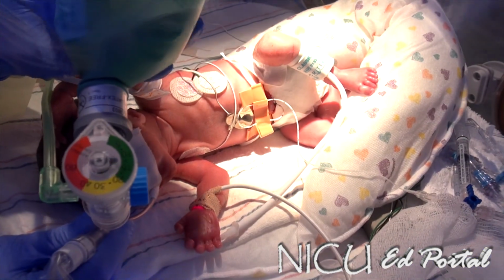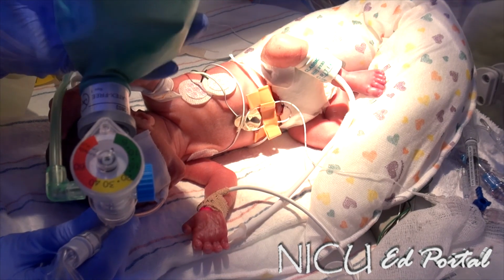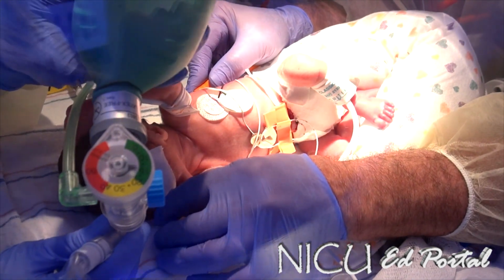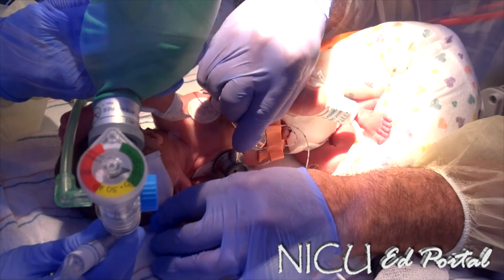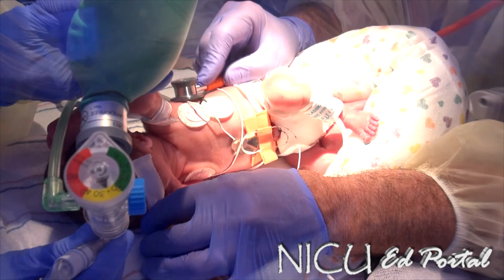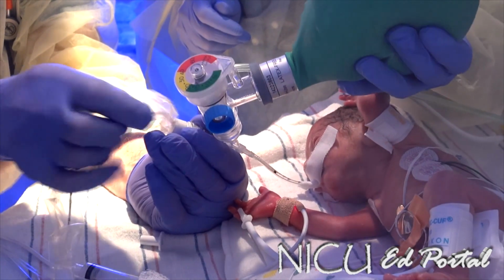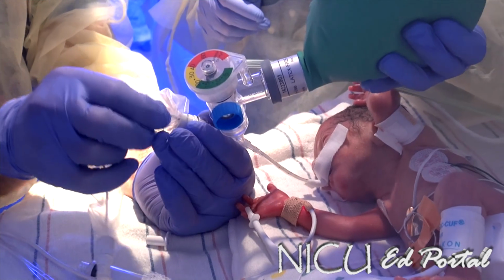Let me just listen, make sure I didn't do that. I could probably put this up now. Should just take a couple of minutes. It shouldn't be too long. You're bagging with 25/5. Nice job. Right. Yep. So we're going to go down. Keep bagging through the whole time? Yep. When I actually do it, I'll grab the bag because I'm going to keep it up. Now, let's see how we go.